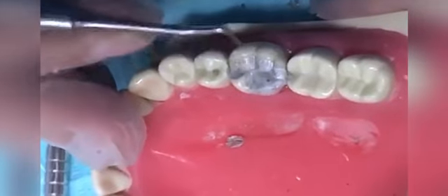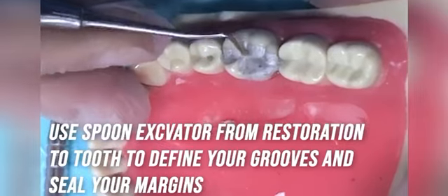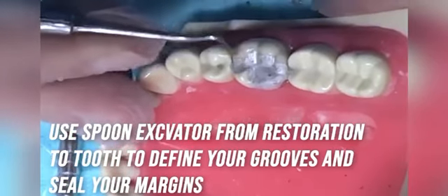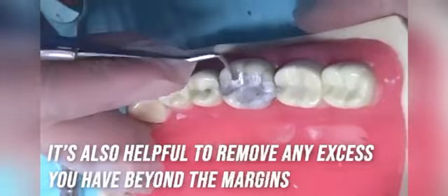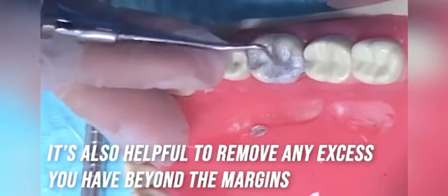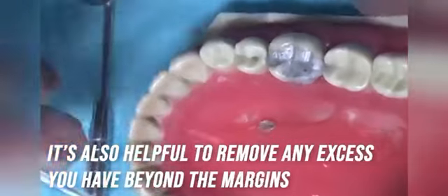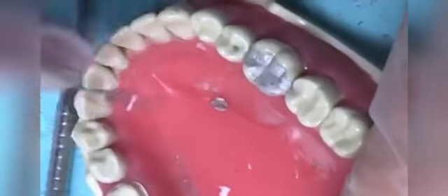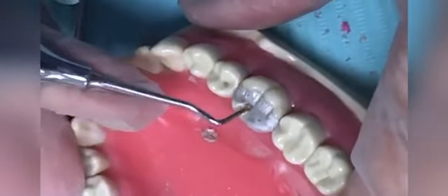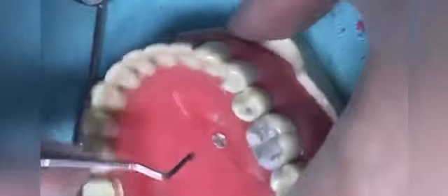One of the criteria is there should not be any extra debris. So if there is any debris we can see on the tooth surface, you can just use the spoon excavator or any instrument to remove the debris. But be cautious that you do not create any ditch while you are doing that. In the end, you can use the high suction to remove the debris from the back of the throat.